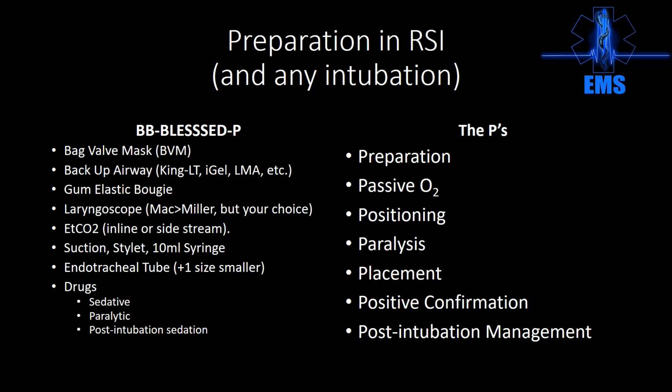Our other friend in EMS for airway management is the bougie. I still call it the gum elastic bougie. I can't get it out of my head. It's no longer made out of gum elastic; it's made out of plastic. But the bougie is a great tool when properly deployed. It allows you to control a very difficult or invasive airway with a much smaller tube rather than trying to negotiate the big ET tube.